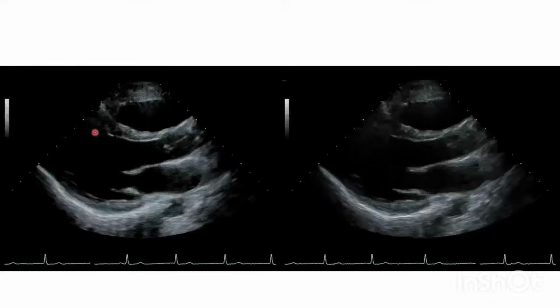Let's say, for example, an LV thrombus or a small thrombus sitting here. If we change the map, sometimes this thrombus may become very evident because it is having a different shade of gray. Similarly, various structures can be made out clearly when we change the map.